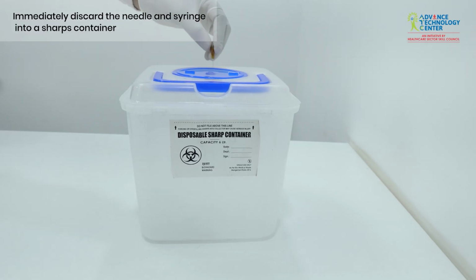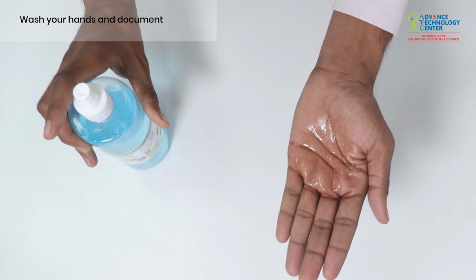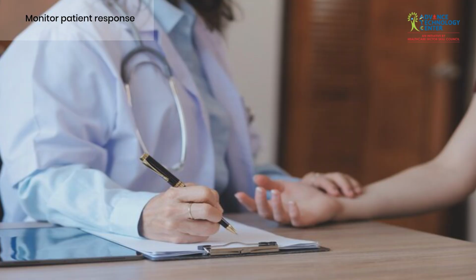Dispose of the used syringe and needle in a sharps container, never recap. Perform hand hygiene to prevent infection, then document the time, dose, route, and injection site accurately. Observe the patient after the injection for any pain, swelling, dizziness, or allergic reaction, and document the response.